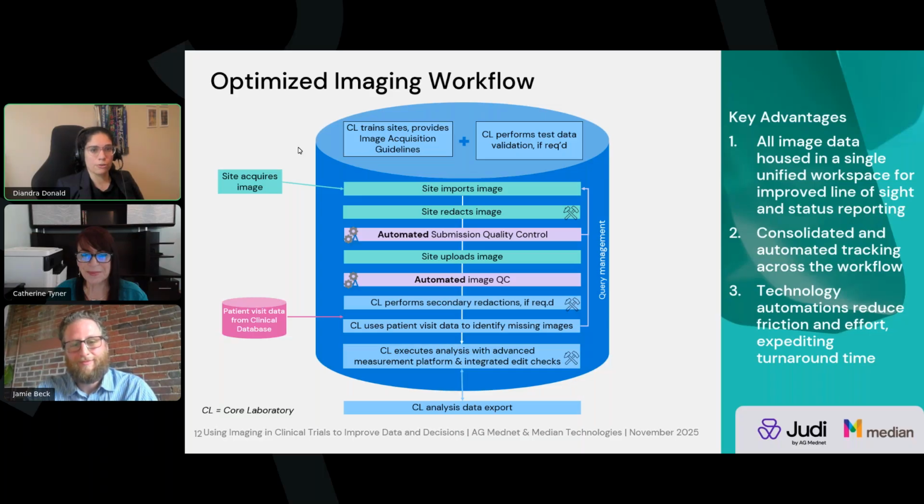Throughout this study, our organizations implemented a highly optimized workflow by providing training with the image acquisition guidelines, providing any troubleshooting or technical support to the site, and performing test data validation to ensure the complexity of MRI scan acquisition was addressed, ultimately preventing data loss on any acquired images to ensure images were evaluable per study objectives.